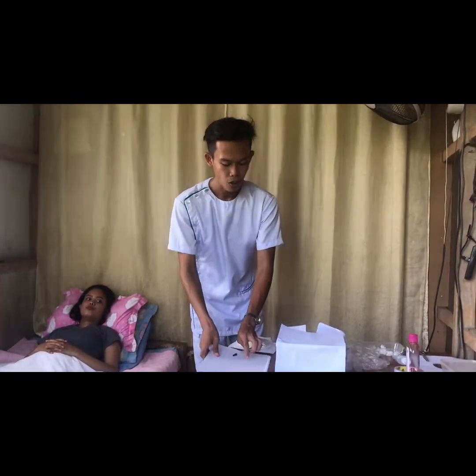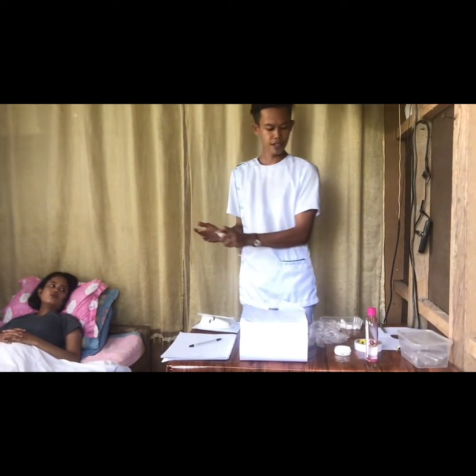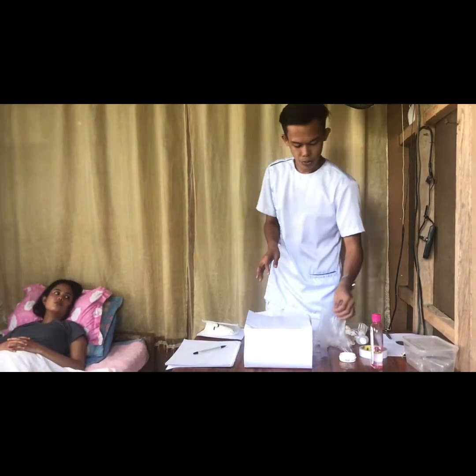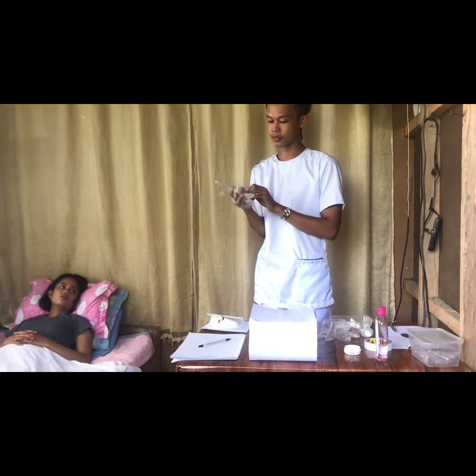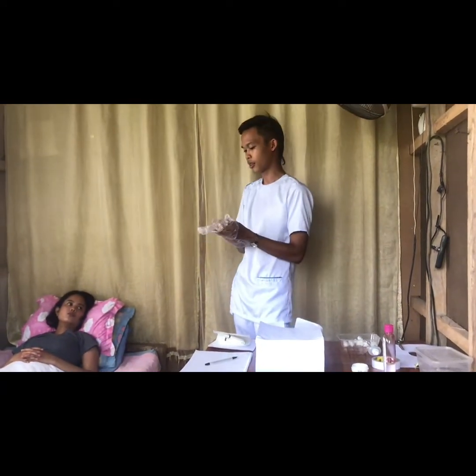So the first thing that we're going to do is to have the pericare for the penis of the patient. For the pericare, we first sanitize our hands in order to eliminate microorganisms. At the same time, the hand sanitizer helps make the hands clean. Okay, so for this time, I'm going to wear my working gloves because I'm going to do the pericare, okay?